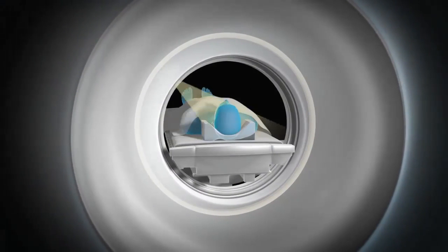Okay, why does it need to rotate? Because if it stays at one side, let's say it stays here, and then the X-ray comes through, comes to the skin here, right? And some X-ray might be blocked by, let's say you have a bone here, then it will block the X-ray so that it cannot detect on the other side. That's why the X-ray has to spin to the other angle. So it takes from this side, from this side, from this side also. So every single angle for just one slice. Like one slice means, because this thing, it will push it in, into the tunnel.